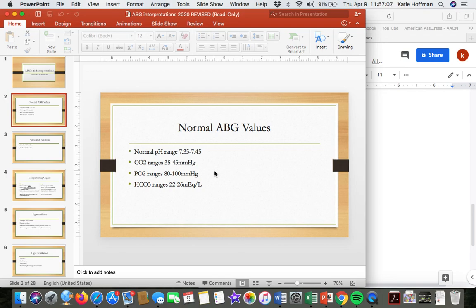I hope that made a little bit of sense. There's one other thing that we want to touch on, which is the base excess, which you'll see on the ABG values. From a nursing perspective, really the only thing I use this for is if your patient's ABG looks fairly normal, their base excess can help determine their fluid volume status a little bit.